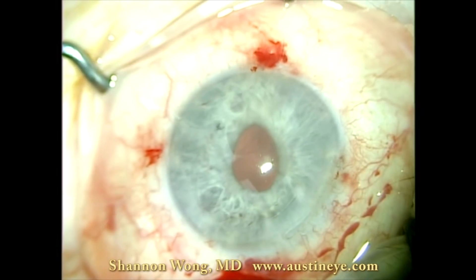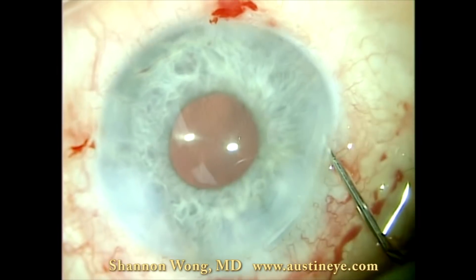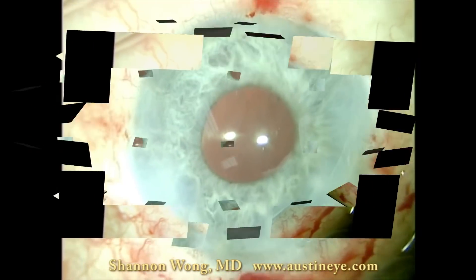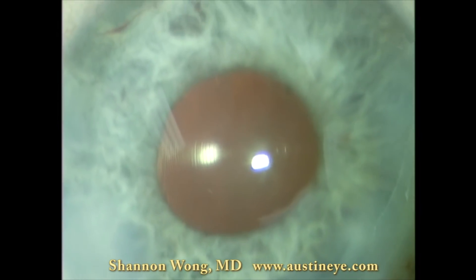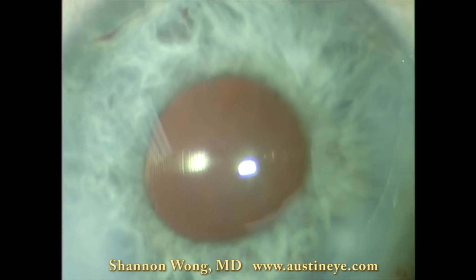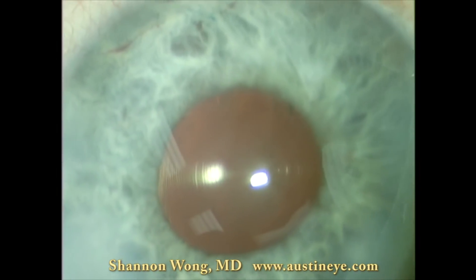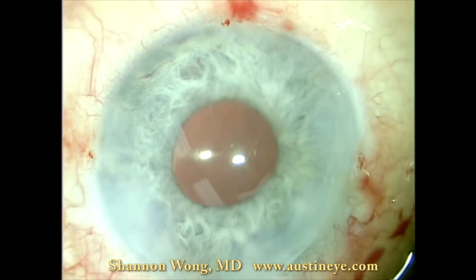We go ahead and do irrigation and aspiration to remove the viscoelastic at the end of the case. We just have BSS in the eye, and you can see how nice and round this pupil is. As a final check, we zoom in on the optic and make sure that the lens implant is well centered. We have the patient look at the microscope light, and as you can see, this lens implant is essentially perfectly centered. So we've managed a difficult situation with an open capsule and a multifocal lens — this lens is now in the posterior chamber, well centered, and the patient did great. Thank you for your time and attention. I hope you enjoyed this video.